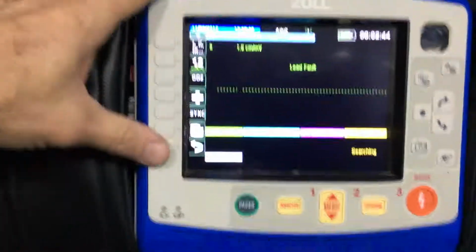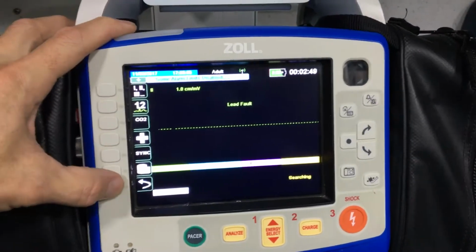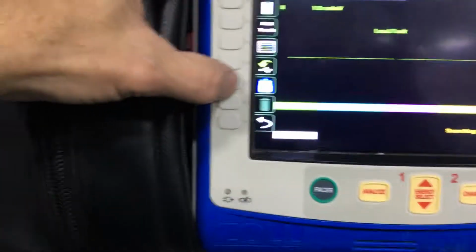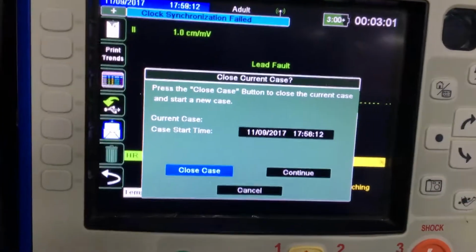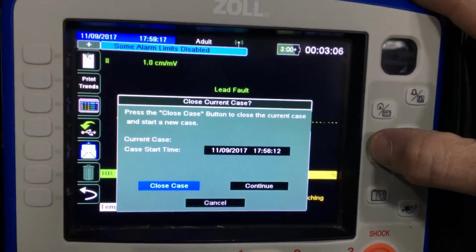So after you're done with your call, you go to log, hit your envelope, and it brings up this. So the initial screen is close current case. You just hit this button here and close it.